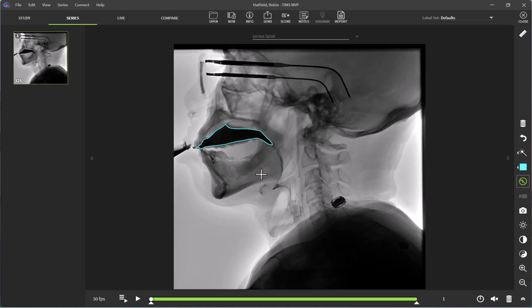I am next going to set this as 100%. To do this, I am going to click on the measurement tool here in the top right-hand corner and I am going to label this as 100.